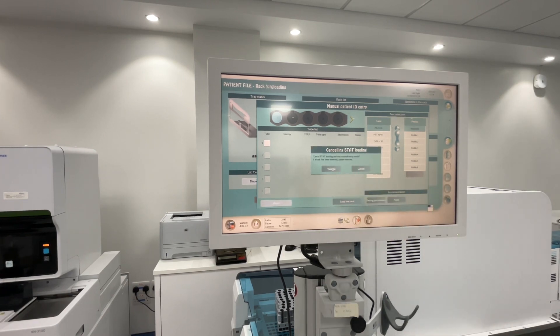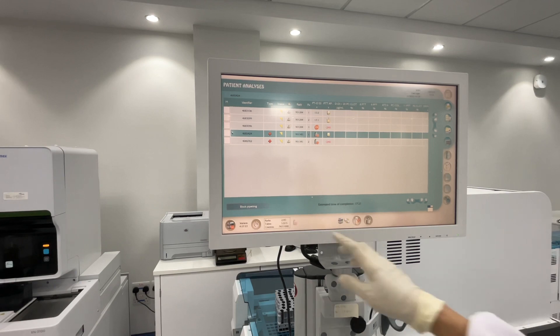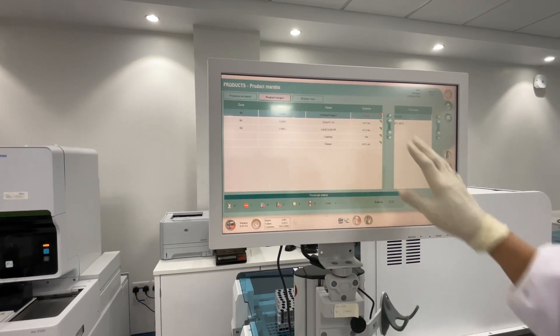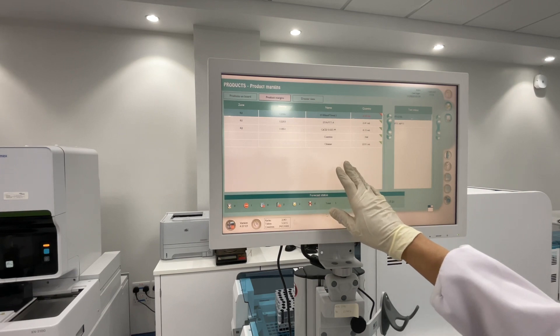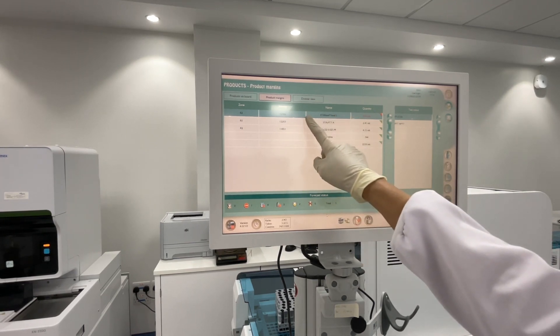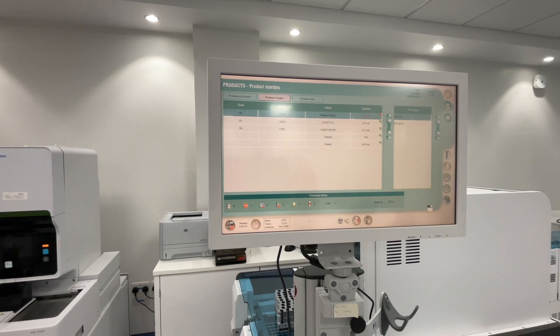Then Validate. Check on the screen - there is a stop indicator. Click this one and you will be redirected to the product margins. A reading of 0.23 means you need to add reagent.